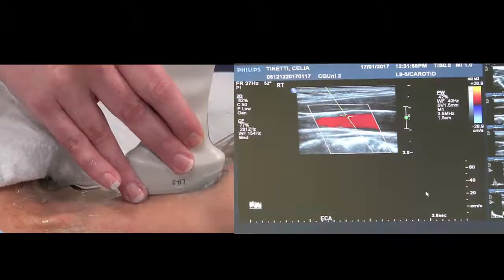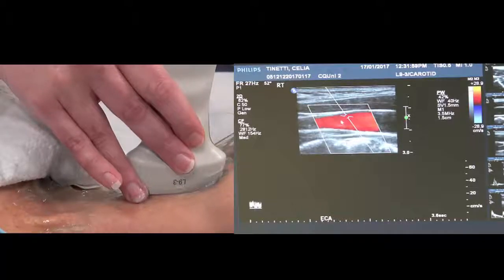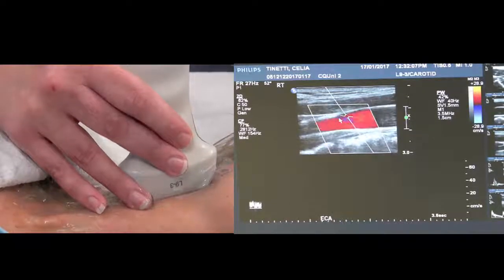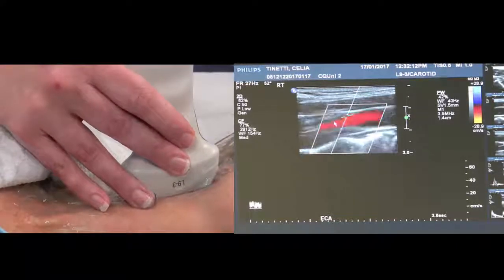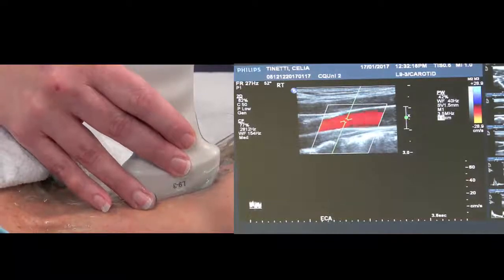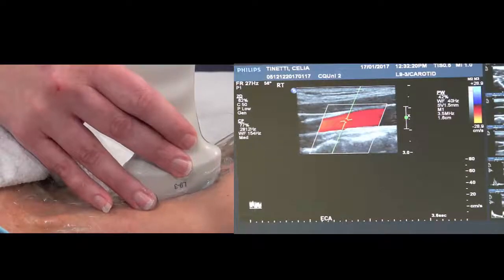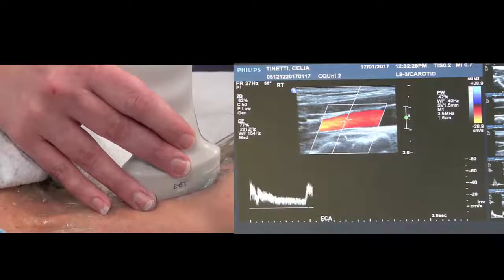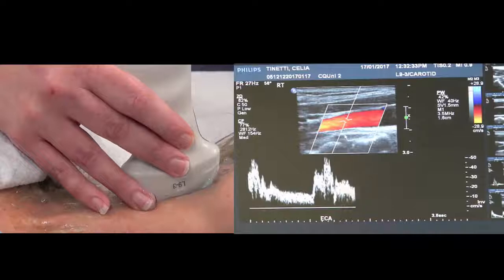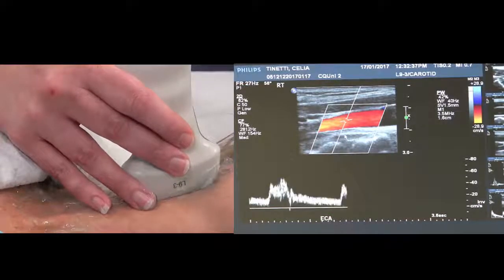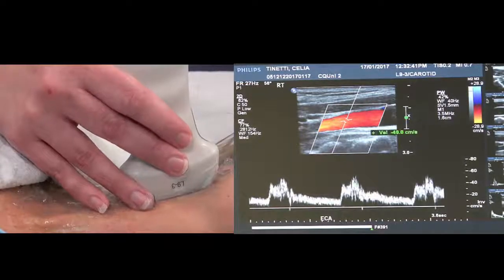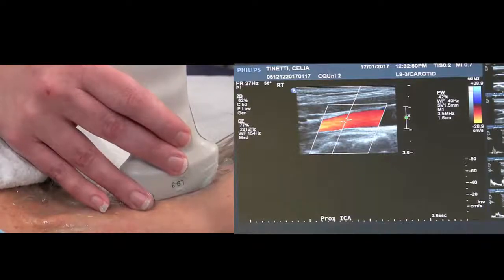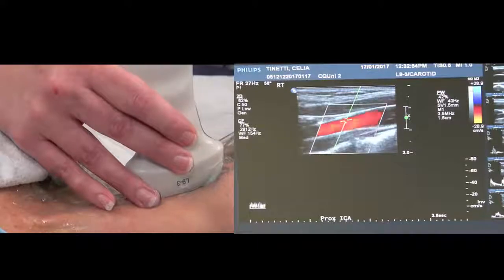Now ICA — you've got to work out which way you're going. The bulb is here, so this is really ICA here. If I heel toe that way, looks like I could get slightly more that way, so I'm going to change the angle. Already you can see how much clearer that image is. You want to make sure that the angle is right — watch that it's not over 60. Parallel with the fastest flow, not necessarily the wall. I'd rather you try it, waste a second doing it. It might look like it's a small trace, but it's actually the right trace for this patient. And if you fall off, make sure you go back to the right vessel.